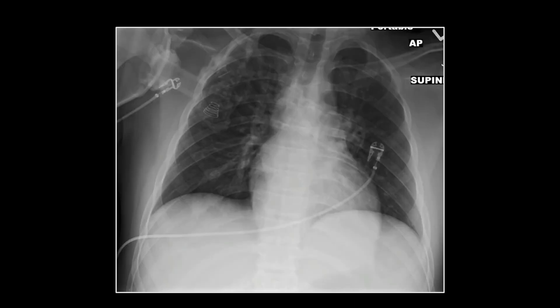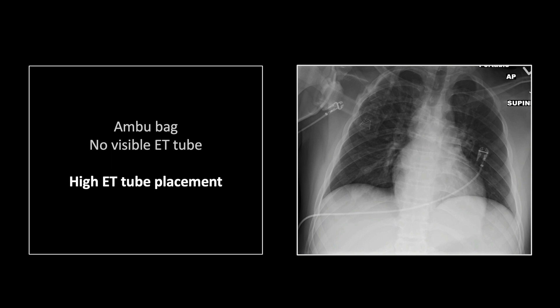We'll begin with this case of an absent endotracheal tube. This case came across with a clinical history of code, and importantly, our radiologist noted the presence of an AMBU bag. A ventilation bag can be attached to a mask as easily as to a tube, but in the setting of a code, one of the fundamental primary events is endotracheal intubation. So when you see an emergent chest x-ray in that setting, it is wise to look for an endotracheal tube, and if you don't see one, to contact the clinical team and ascertain whether or not they believe one is present.